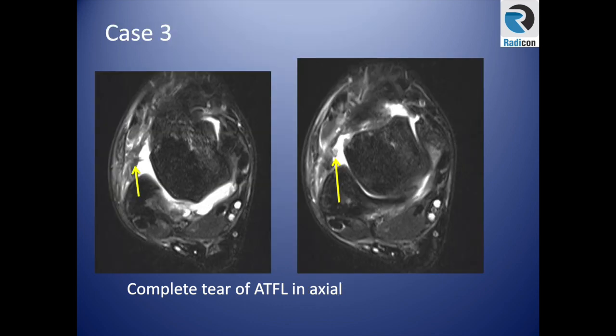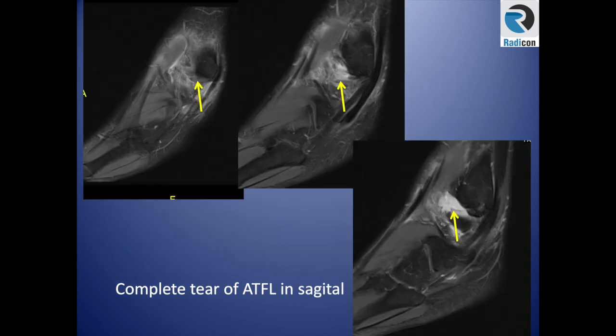Case three: again at the level of the coma shape, there is extensive fluid in the gutter with complete absence of any ligament or tissue, confirming a complete tear of the anterior talofibular ligament. This is also visible in other imaging planes.